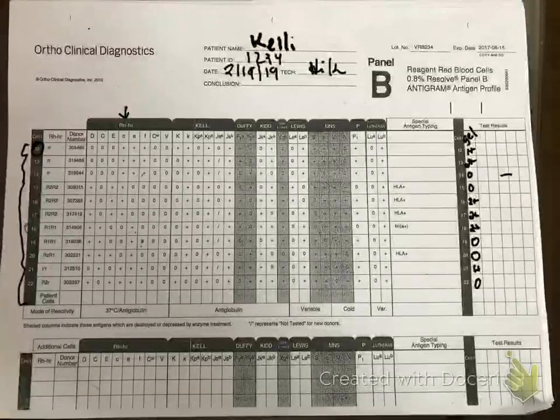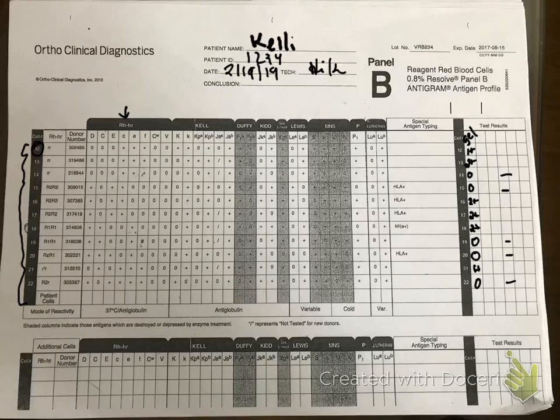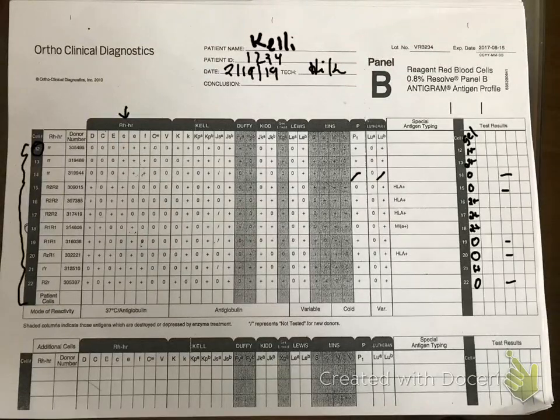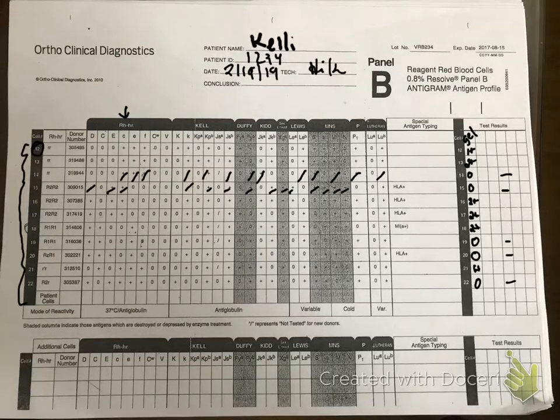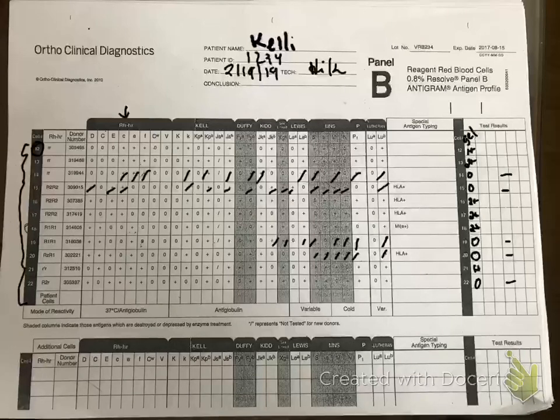The first thing we do is look at cells that have no reactivity. These negative cells are not finding the antibody, so whatever antibody is in this patient, it's not reacting with those red cells. On the cells with zeros, we go ahead and cross off all of the pluses — we do that for cells including 19 and 20.